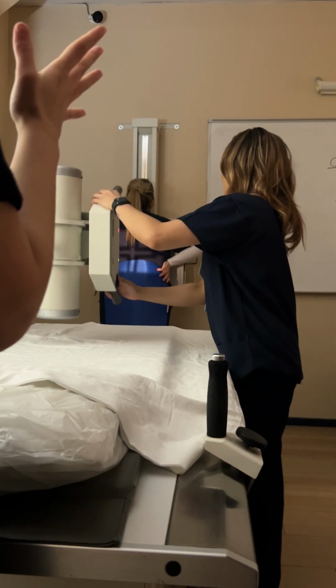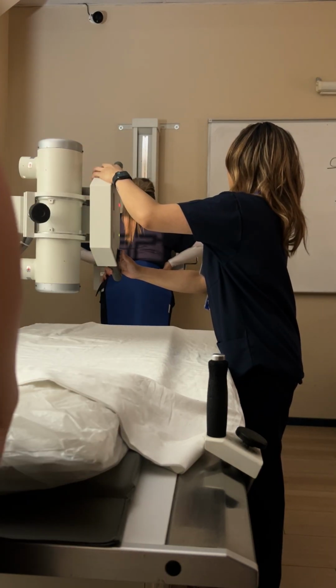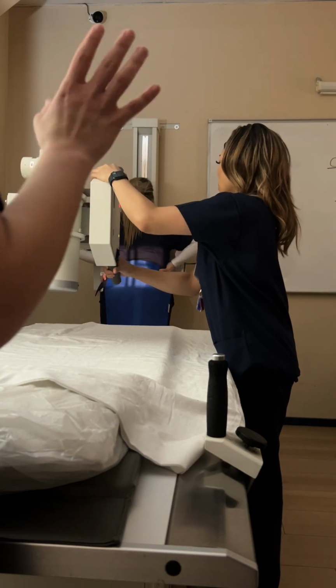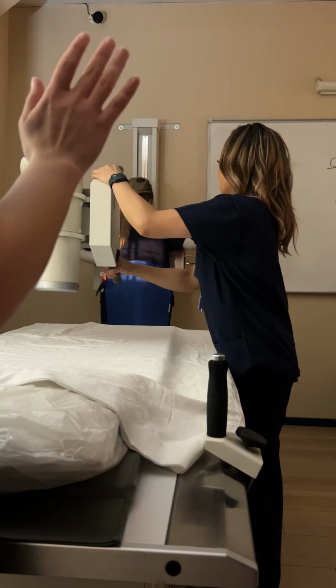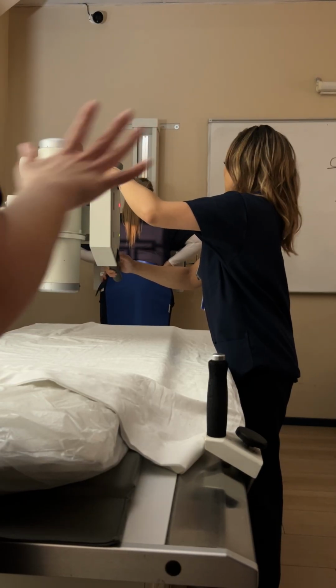What's your name and date of birth? And then they tell me that. I give them the shield and I tell them exactly how to do it. Then I have them go up to the board and then I explain everything to them. I don't even touch the patient. I just explain it to them. Yeah, just try not to touch them.